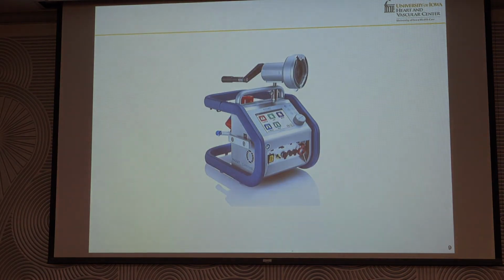And this is the next generation. And you saw that gigantic oxygenator and just disgusting tubing setup from the setup in 1971. All of that is right here in one box. The red is the oxygenator, which is strapped to the back. The pump is actually on the back side of this console. All of your information is available right there in your controls. This unit can literally sit in the patient's bed, and we can transport them on ECMO without having to use another cart or anything like that.